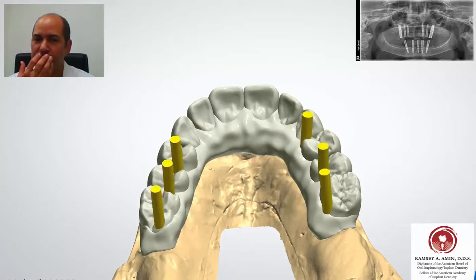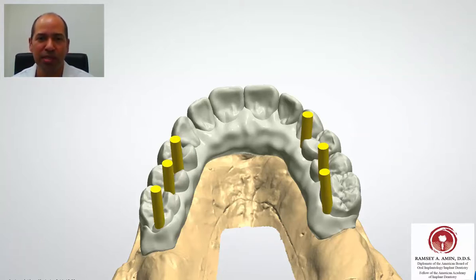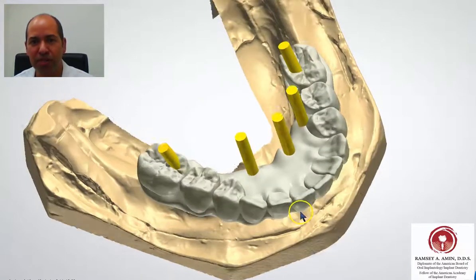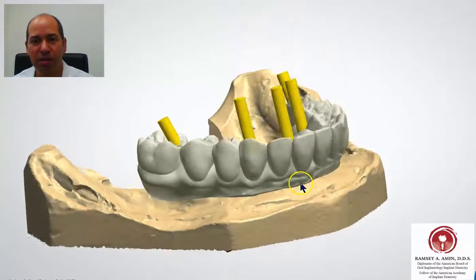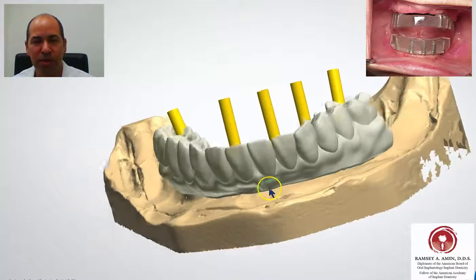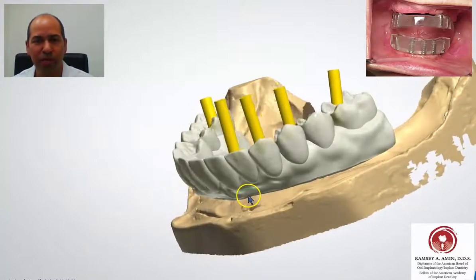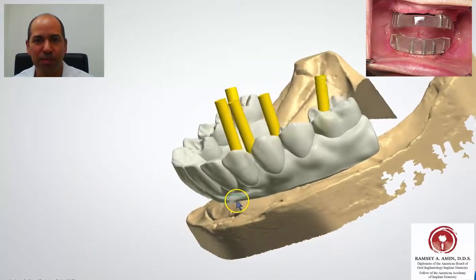We need to determine whether your lip needs to come forward or backwards, how you speak, and whether you can say S's, L's, TH, and F sounds properly. You can see the implants — the yellow part coming through the jaw — and on the bottom they're purposely angulated backwards on the lower right and left far-back most implants.